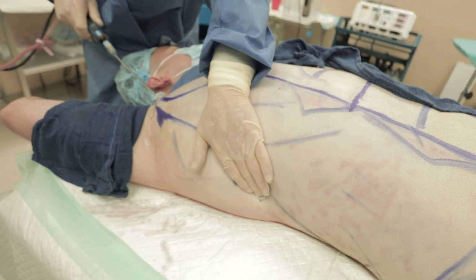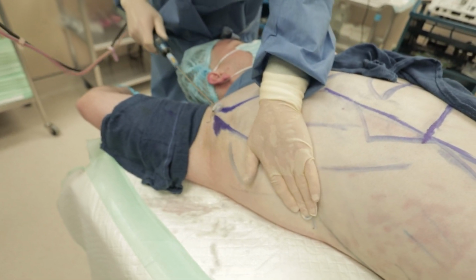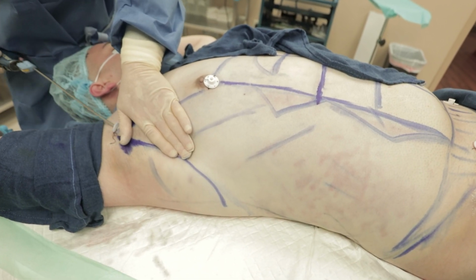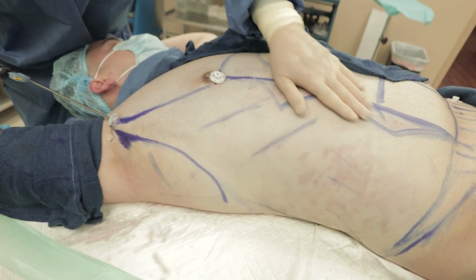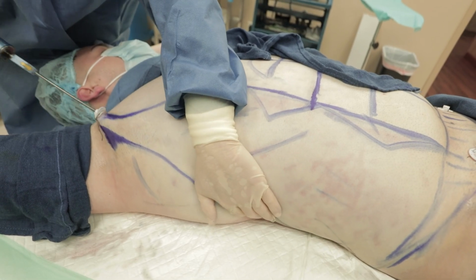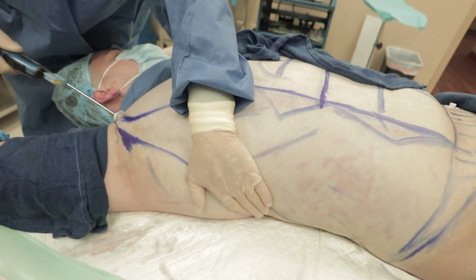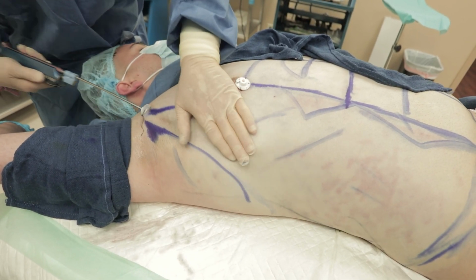this muscle and leave volume where I want it, like the lats and the pecs, and even add volume where I want to enhance, and of course extract volume where I don't want it anymore, like this beautiful triangle. And you can see already what I'm doing here, how the lat is starting to pop. Right there, you can already see it.